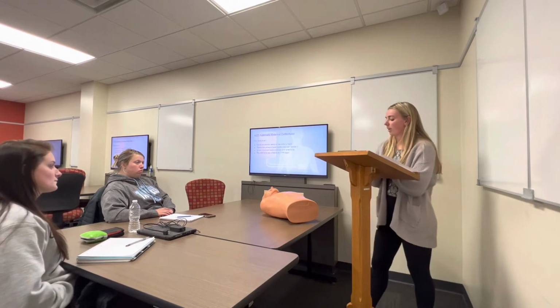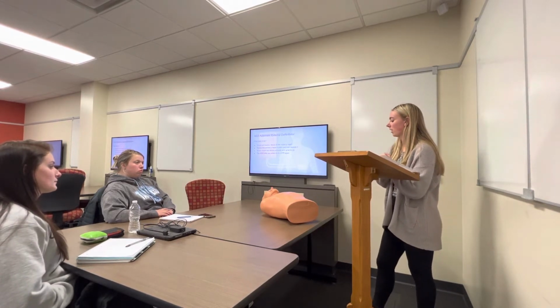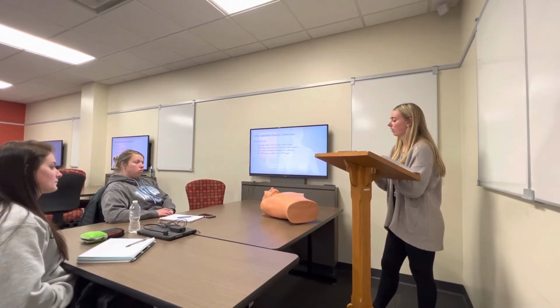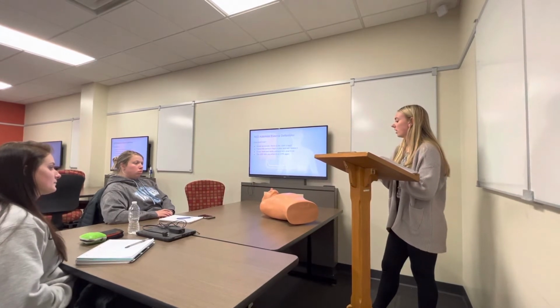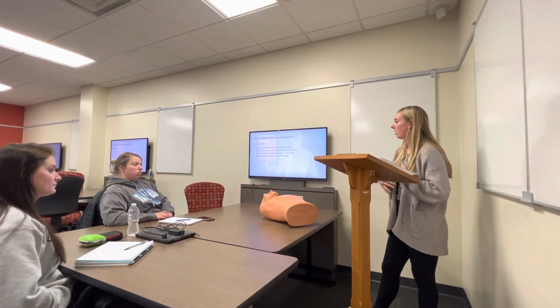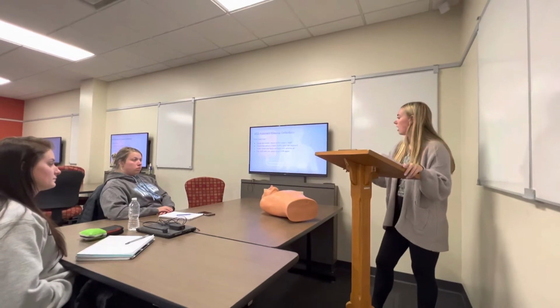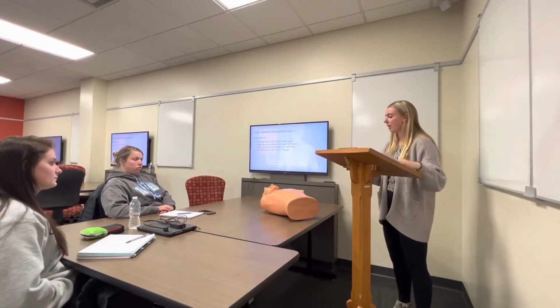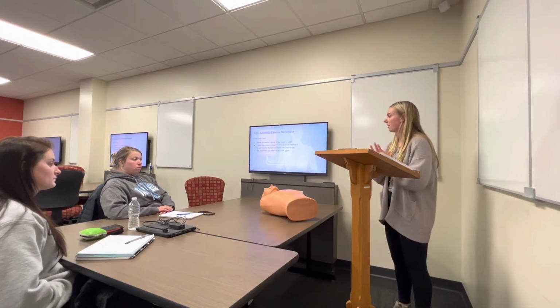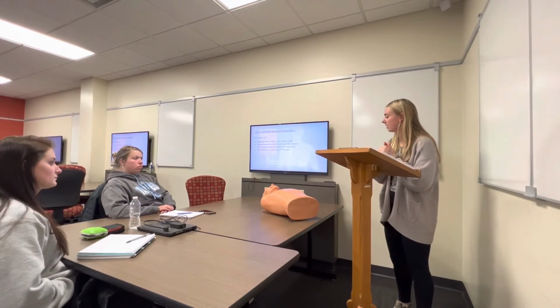When the AED becomes available, you'll turn it on, and then you'll want to remove the clothing from the victim and attach the pads correctly. You'll just have to remove the clothing covering the chest. If the person is sweaty from a run or swimming and their chest is wet from sweat or the water, you'll want to try to wipe that off with something so the chest is dry and the pads stick to it. If it's a man who has like a hairy chest, sometimes an AED will have a razor in there. Otherwise, the pads are sticky, so you can place them on and rip them off, and then they have new pads in there you can replace it with.